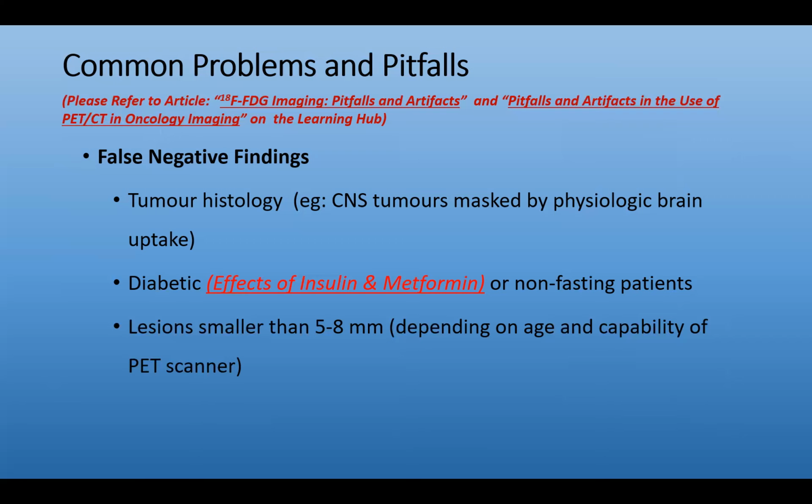Sometimes we get false negative studies in diabetics, again, the effects of insulin and metformin, or in patients that are not fasting. This can result in uptake in muscle and bowel, and that may end up masking potential lesions in the abdomen.